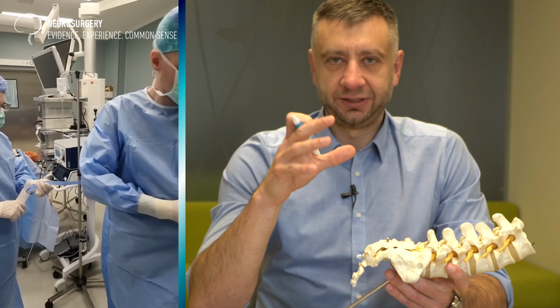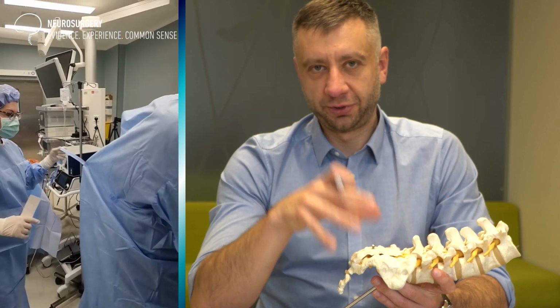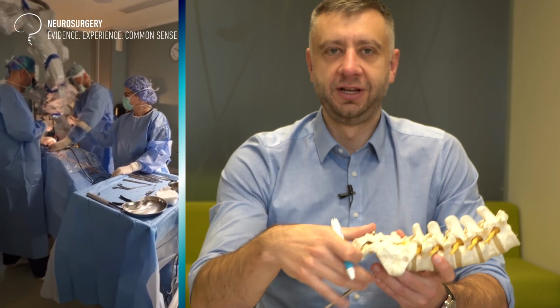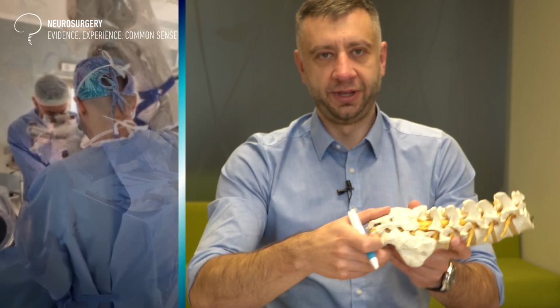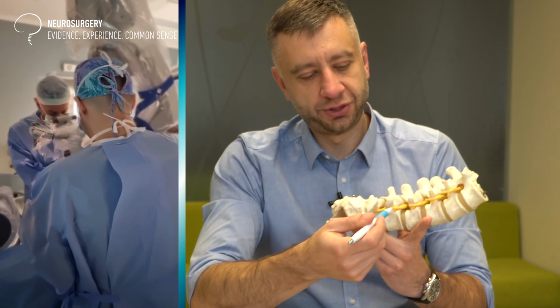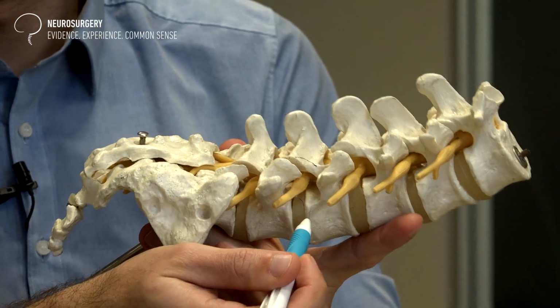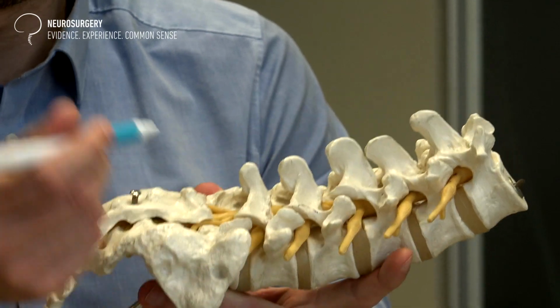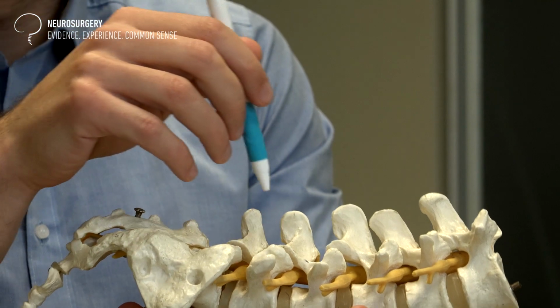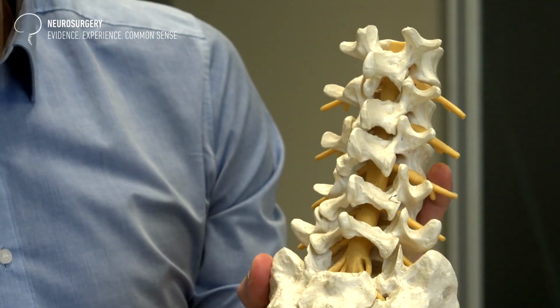So what is lumbar microdiscectomy? It is a standard, quite commonly used surgical procedure which is performed under general anesthetic. The patient is lying on his or her belly. Let's imagine we need to take away a disc herniation between L4 and L5, which means between the 4th and 5th lumbar vertebrae, from the right side. So I will turn the model so you can see better.